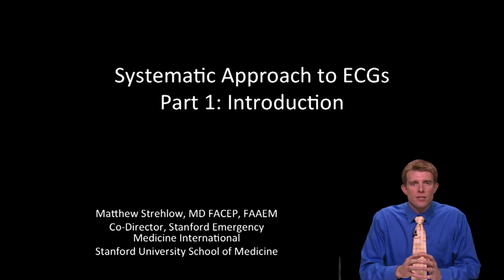Why is it important to be able to evaluate ECGs well as a healthcare provider? Well, if you practice in almost any setting, you'll eventually come across an ECG. If you're practicing in a busy emergency or urgent care setting, you can see an ECG every 3 to 5 minutes that someone is handing to you to evaluate. And you don't have much time to look at those ECGs. So you need a rapid approach that identifies the key findings on ECG so that you don't miss immediate life threats when you look at that ECG quickly.